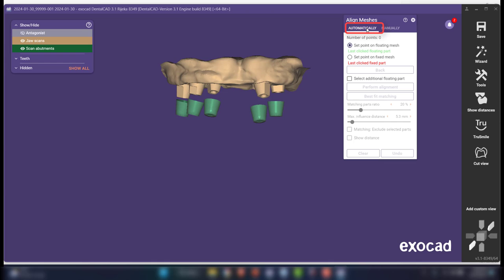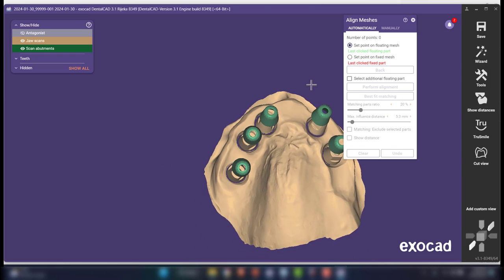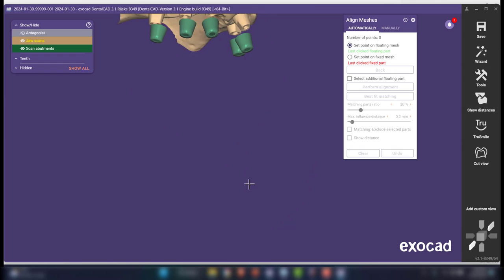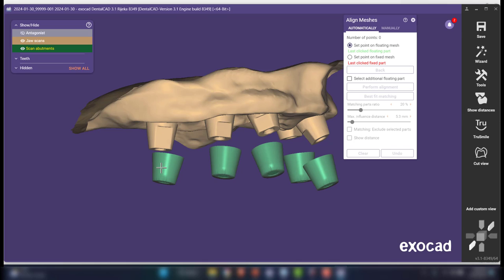Now I need to go back to automatic stitching, and with this method you're going to have to go ahead and indicate 3 points. All right, so you're looking for 3 common points between the data. Now notice here the one I suggested you export is the one that has no flats on it. All right, you could have done the ones with flats, but remember these scanners are not talking to one another. And so if it were to export the scan bodies with the flats, they'd be highly accurate, but those flats would be oriented differently from implant to implant because it's just making up the position. Remember, a multi-unit abutment, things can rotate freely on that. It has no timing built into it.